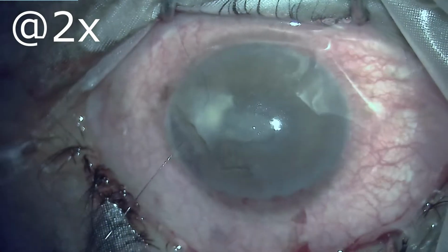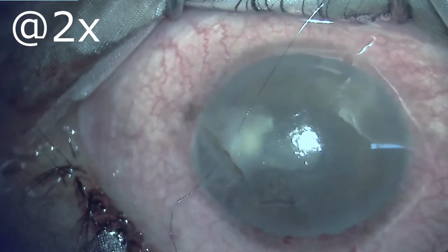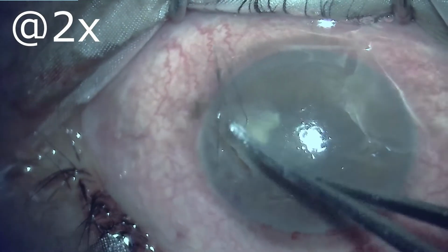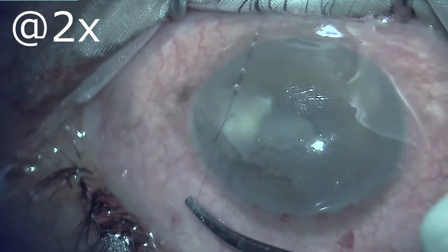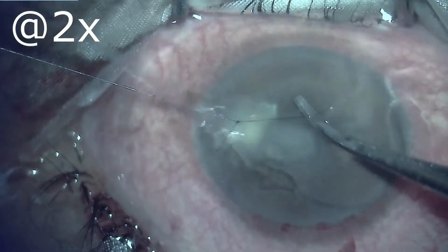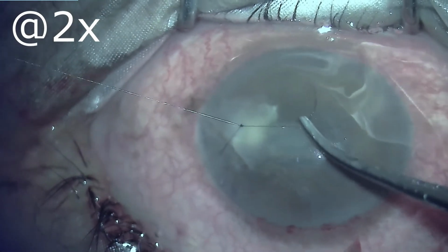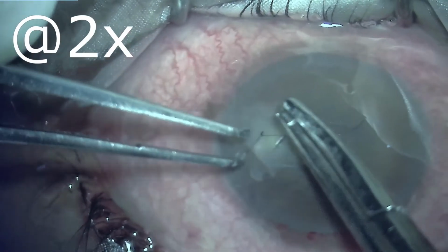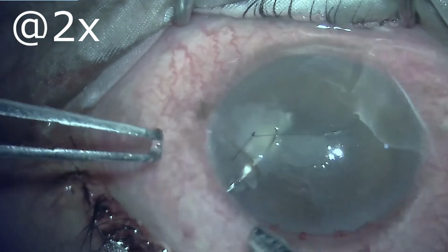In these situations it is important to tie the knots judiciously so as to not cause too much curvature change or astigmatism in the cornea. The first suture is very crucial because it is going to hold against a lot of pressure, and once the subsequent knots have been put up, it may appear a little loose. So one has to be ready for revising the knots and sutures as the surgery proceeds.